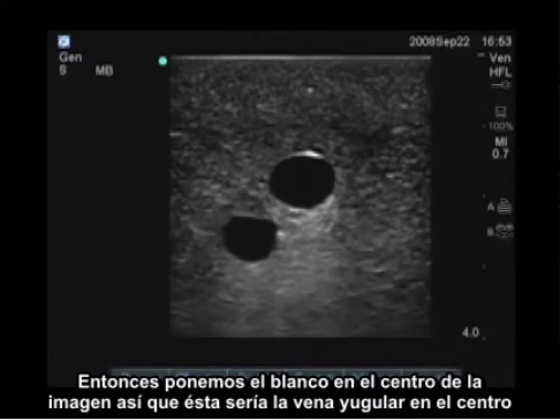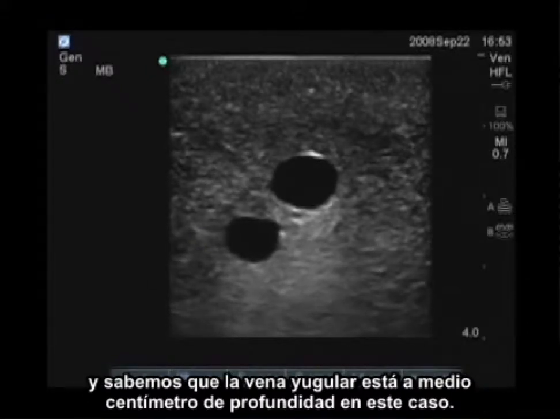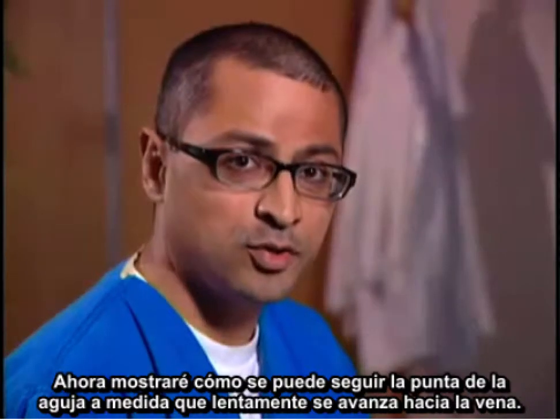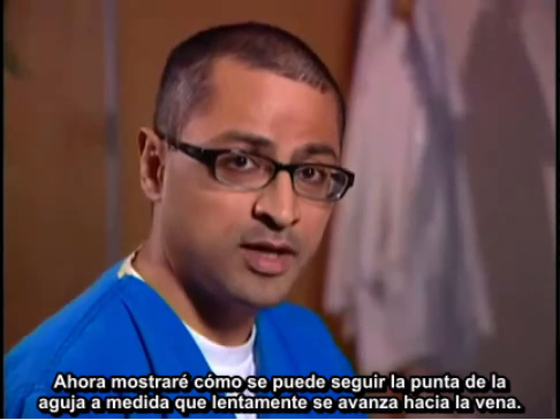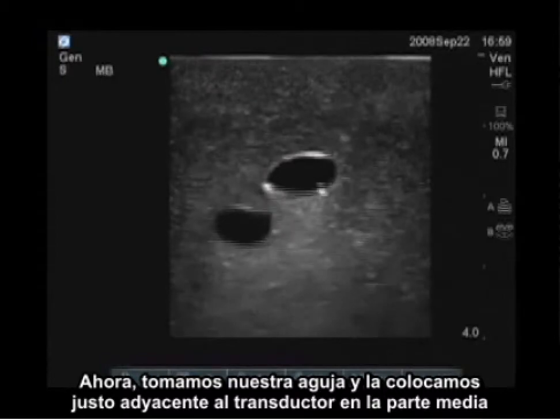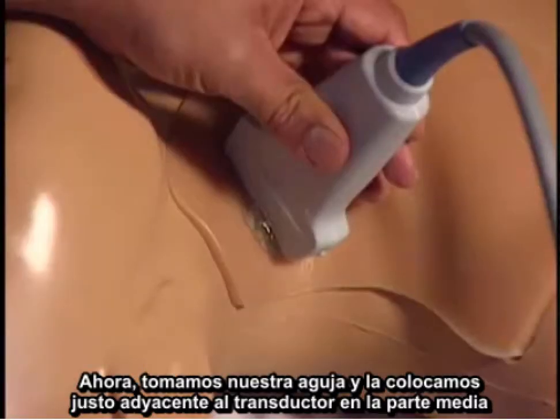So this would be the jugular vein in the center, and we know that the jugular vein is about 1.5 centimeters deep in this case. I'm now going to show you how you can actually follow the needle tip as you slowly march toward the vein. I have the jugular vein centered in the image. You can see it's compressible. We're sure it's the vein.